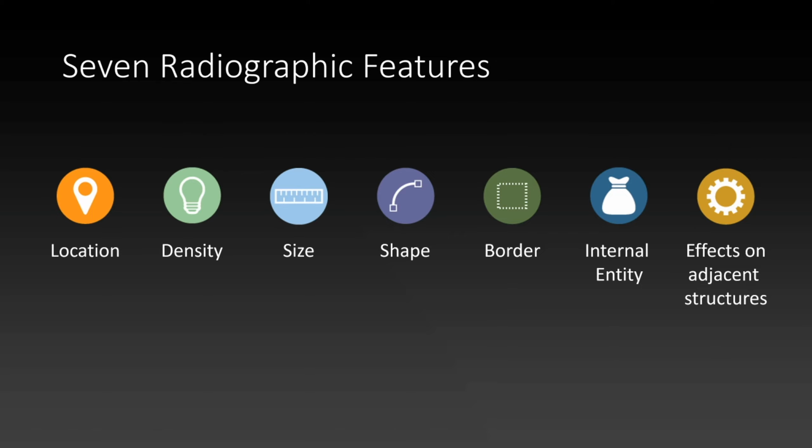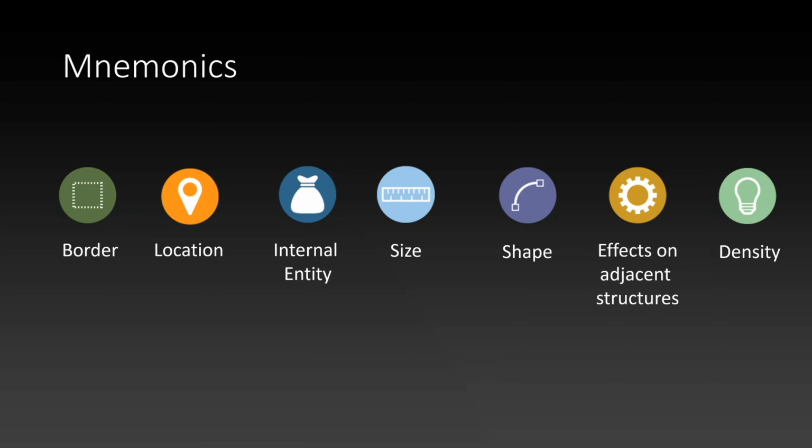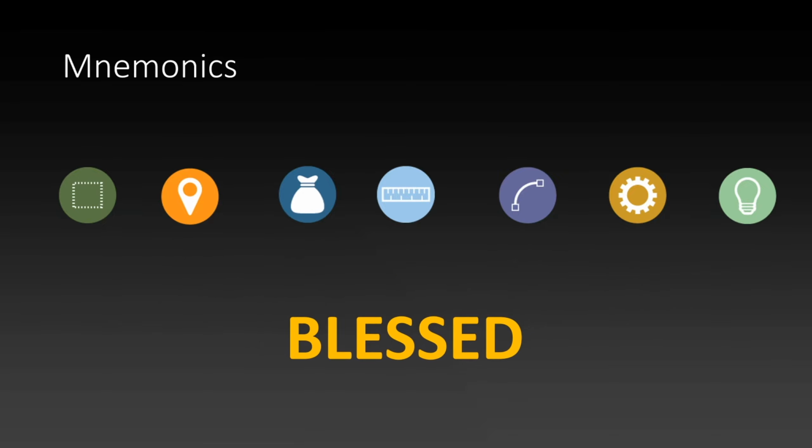You do not have to describe all these features in the order that I have presented. You may mix them up. Let's mix them up to remember them better. I think we can remember them better now. Yes. I feel blessed that I can remember all the 7 radiographic features to describe.